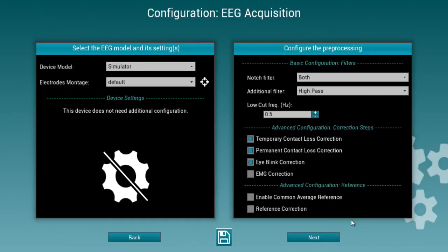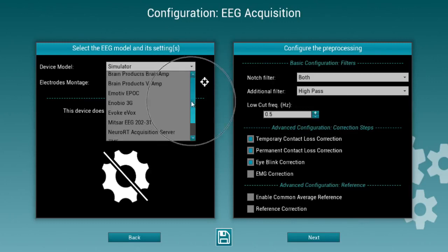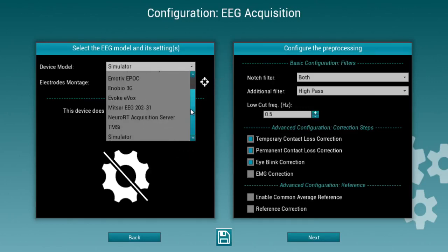Once you've selected the patient, you have to configure the EEG acquisition. In this example, we'll use a simulator where you can choose from a broad range of available EEG amplifiers.